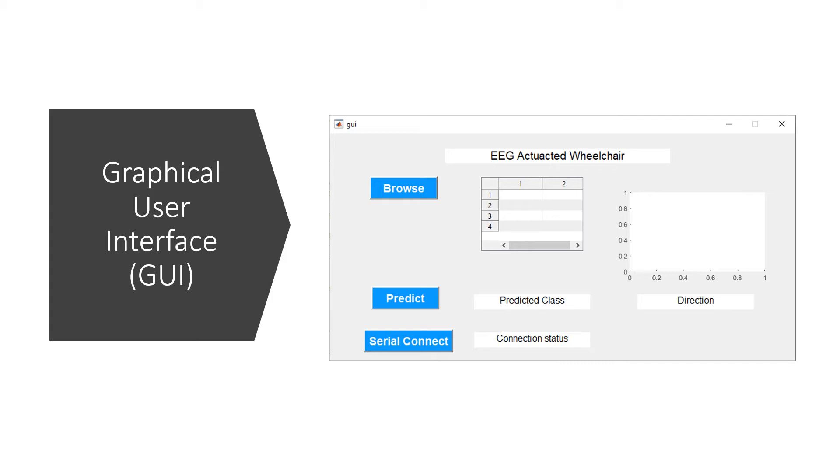The Serial Connect will be used to establish a communication between the MATLAB and the master Arduino circuit. The Browse enables the user to import any EEG data into the GUI and then the Predict can be used to predict the class of the imported data. After predicting the class, the value of the predicted class will be straight away sent to the master Arduino circuit and then again sent over to the wheelchair prototype.